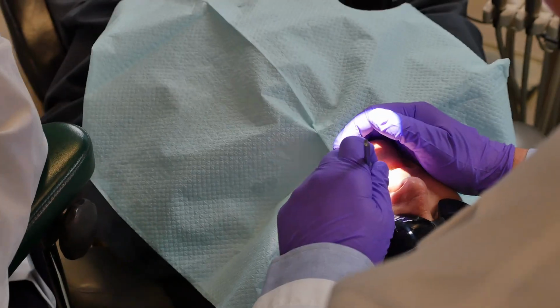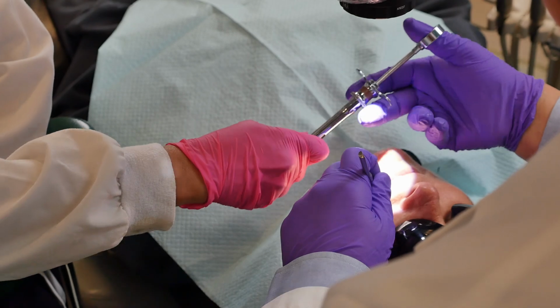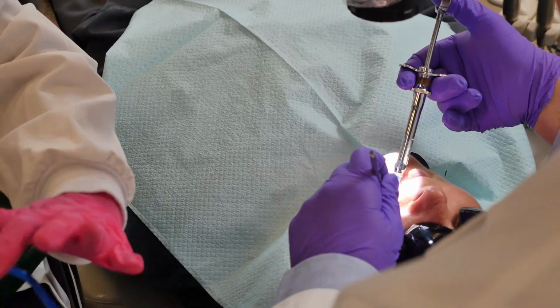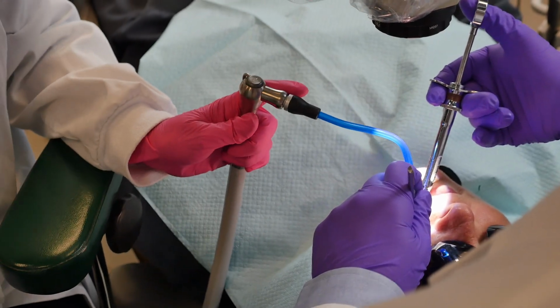I'd like to show you how using video in slow motion can really reveal a lot of problems as you're refining your technique. So let's just take the syringe pass as an example. Here it is in real time.